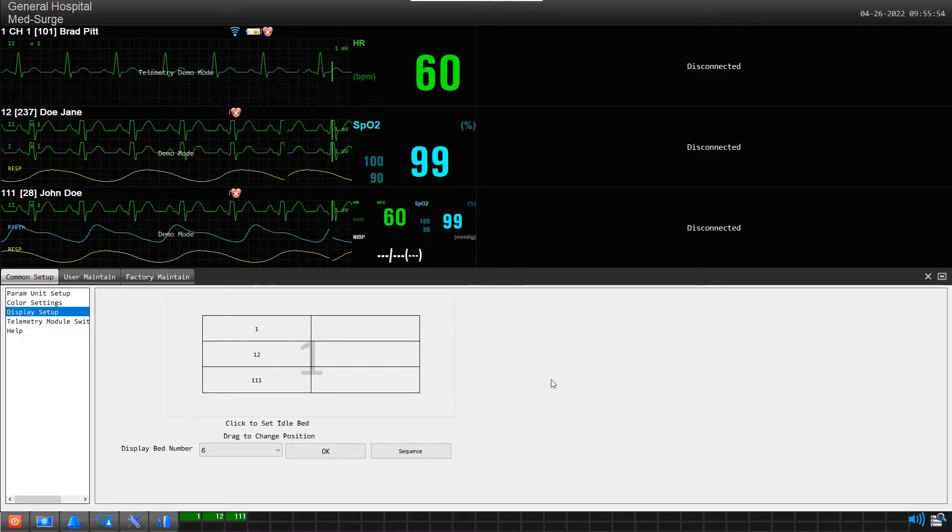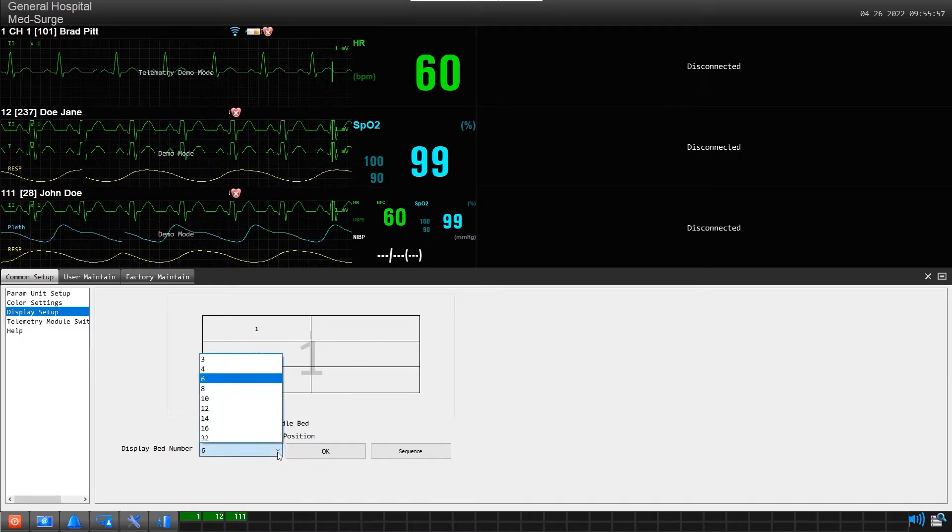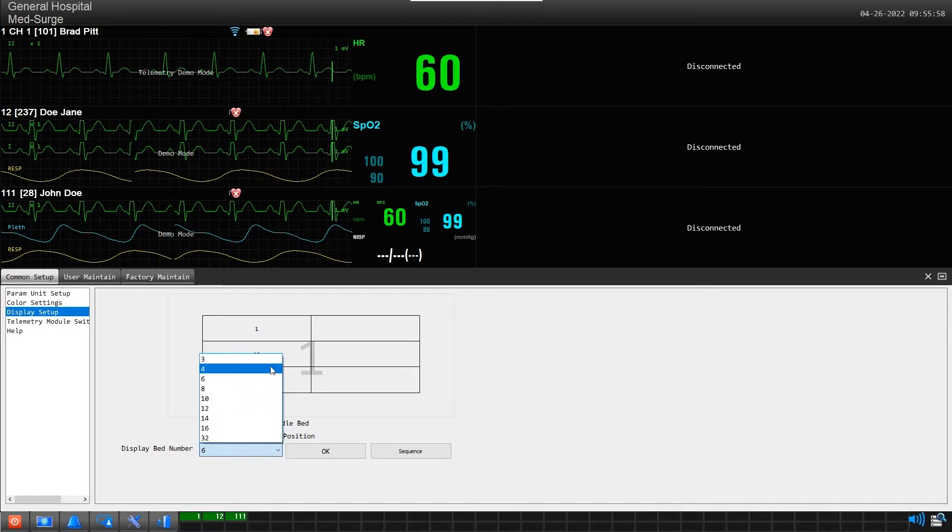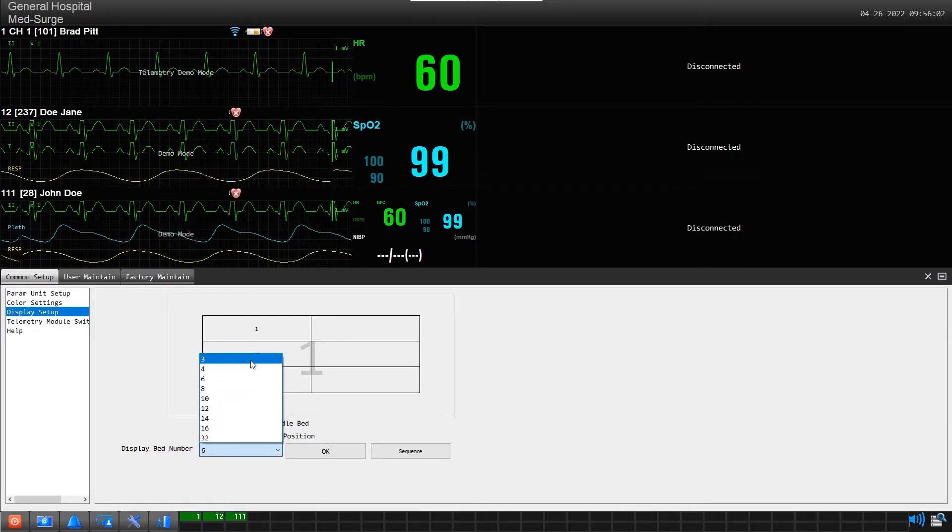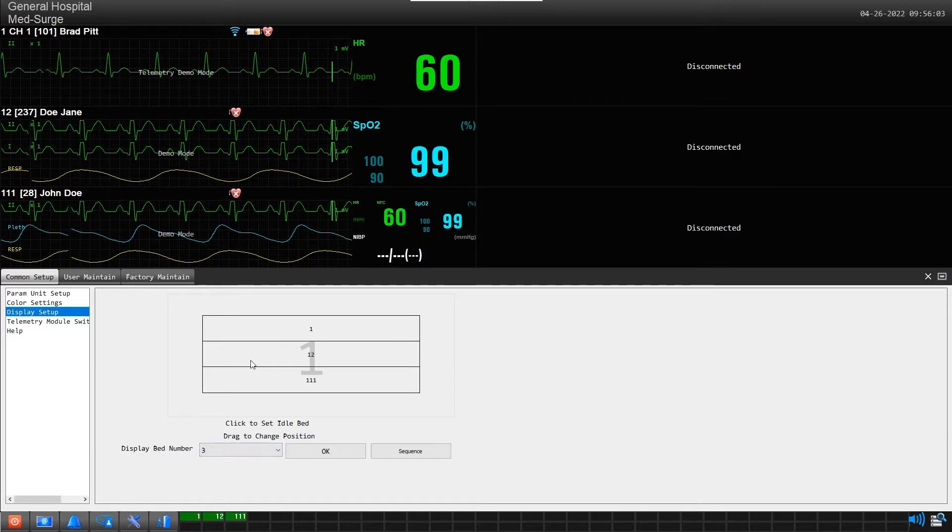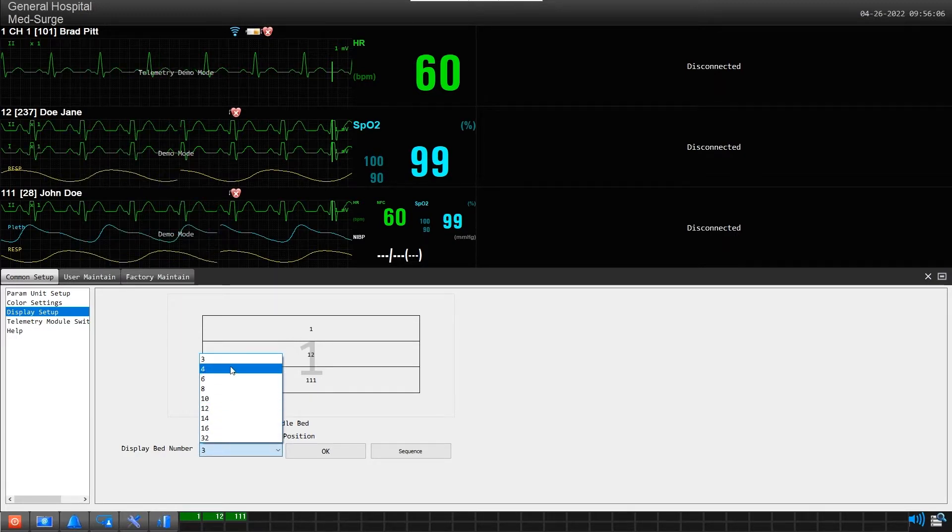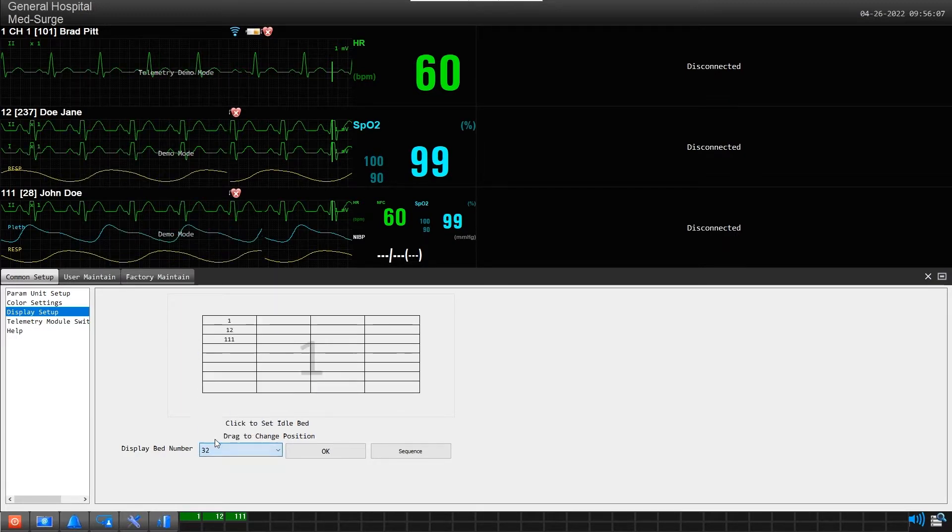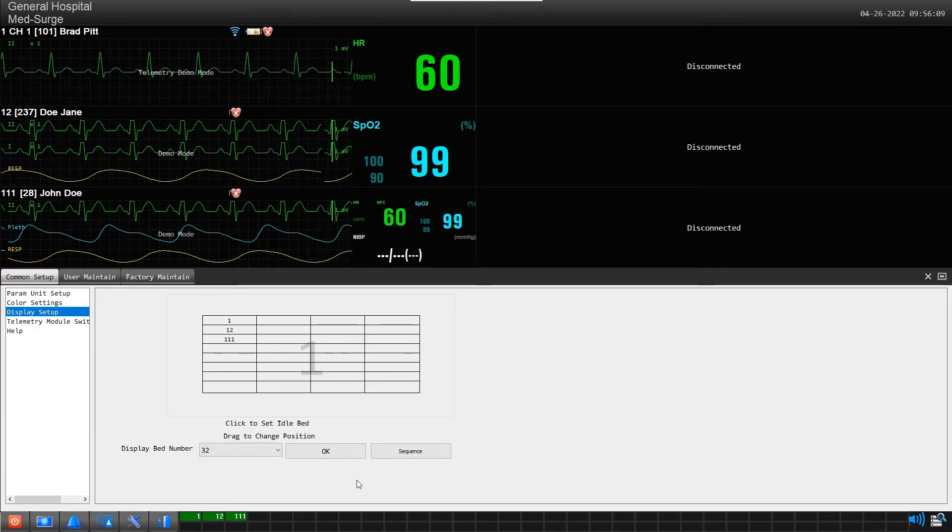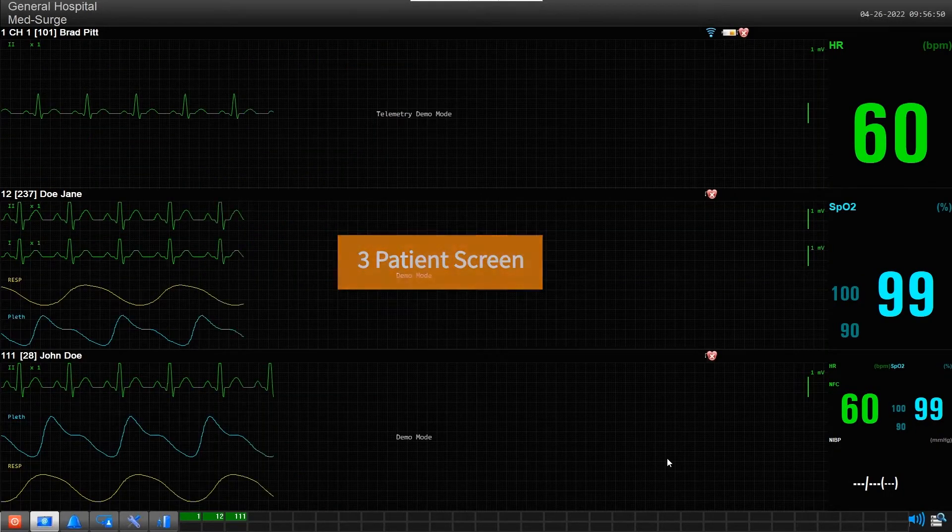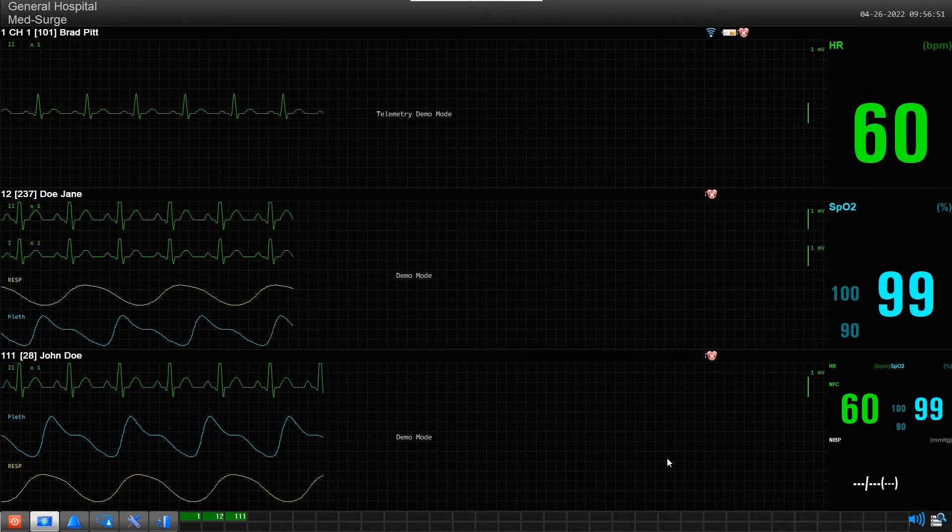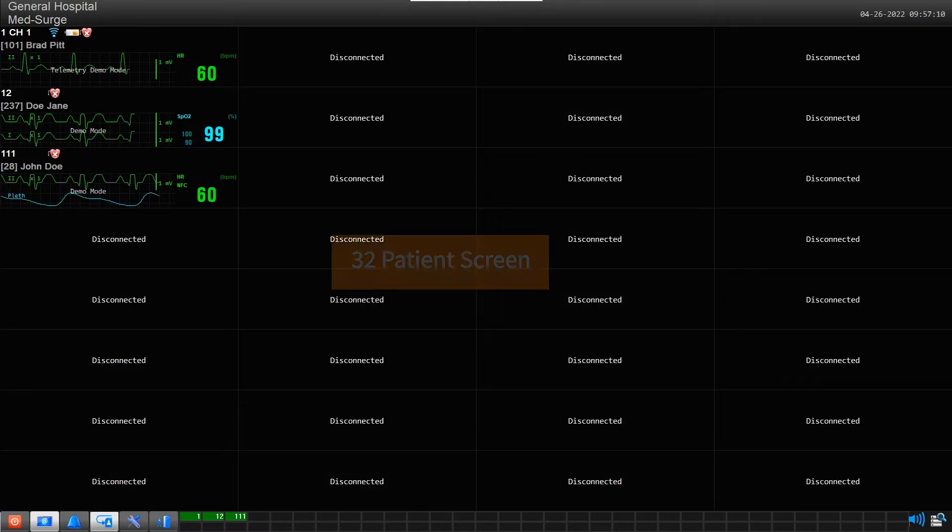To change this, click on the down arrow beside display bed number. From here, you can change patient capacity from as little as 3 patients to as many as 32 patients. For example, this is how your screen would look with just 3 patients. At the other extreme, this is how your screen would look with 32 patients.